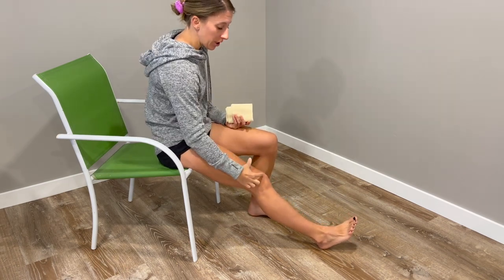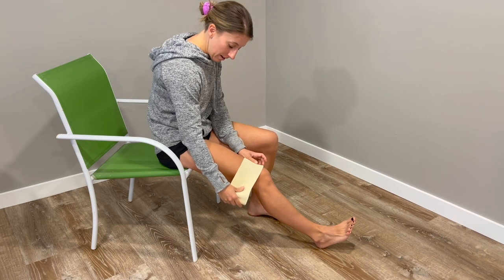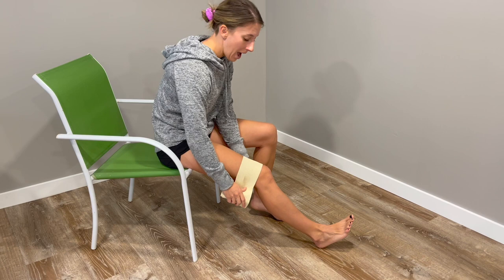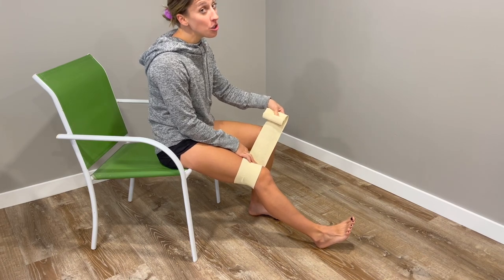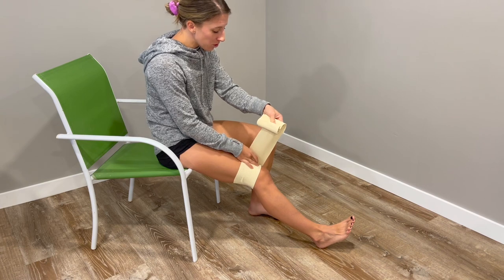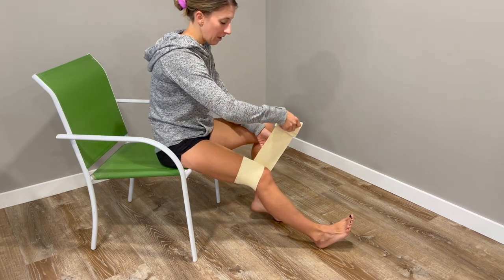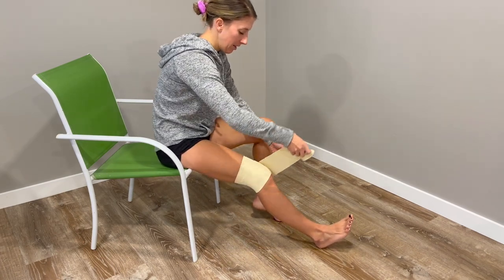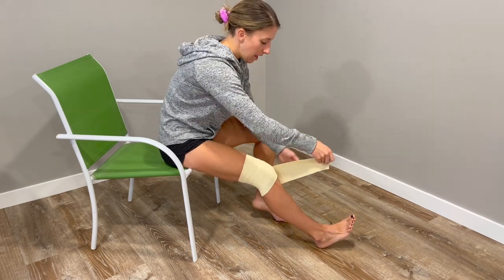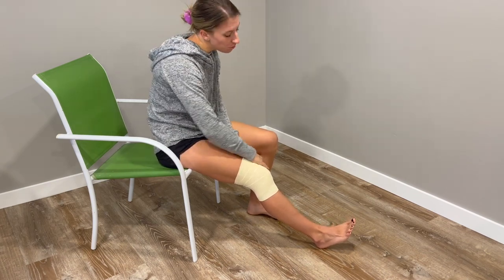Start above the kneecap and place your wrap, using your other hand to hold it there as you feed it around. Pull it tight — not too tight — and come right over that top strap to make sure it's secure. Then repeat, pulling it taut and overlapping about half of the previous strand each time. Note that this type adheres to itself; I'd recommend the softer ones with the little silver clip attachment, which most are.